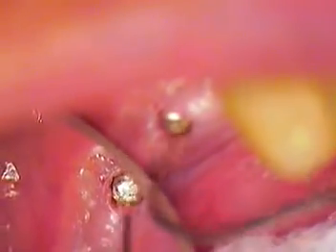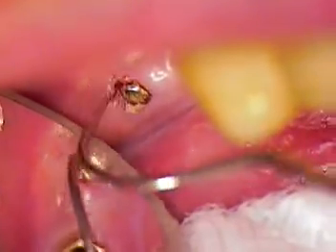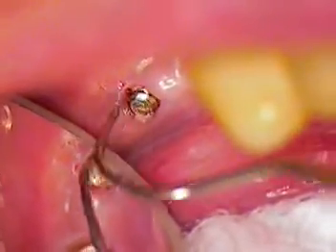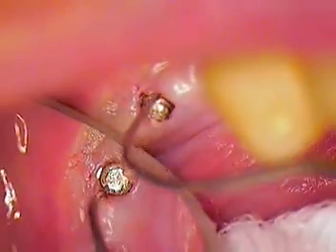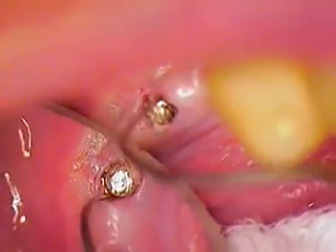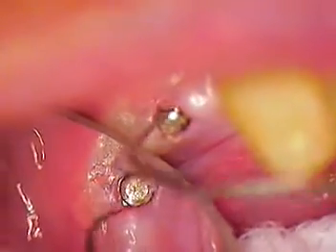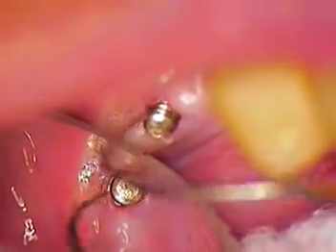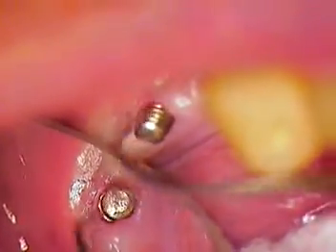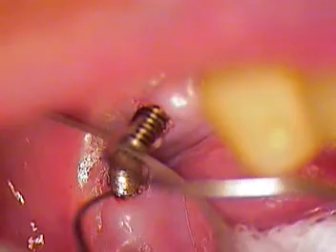I'm sure a lot of you have other techniques going through your mind right now to do the same procedure. I don't like Capitron tips unless I absolutely have to use them, because there's always a chance of shredding a thread. The scope is also so important to have at your disposal — we use it just about for everything, including these really difficult cases. I'm sure there's a need for this kind of treatment out there. Feel free to call me, give me a buzz, I'll coach you through the whole thing.